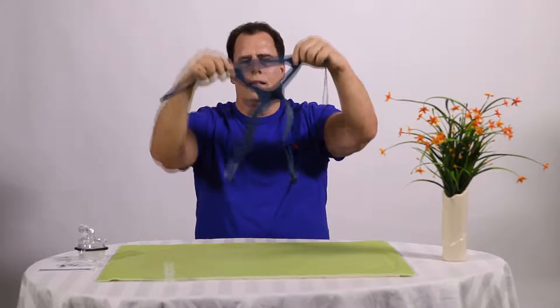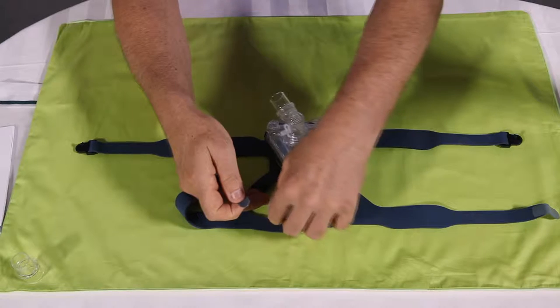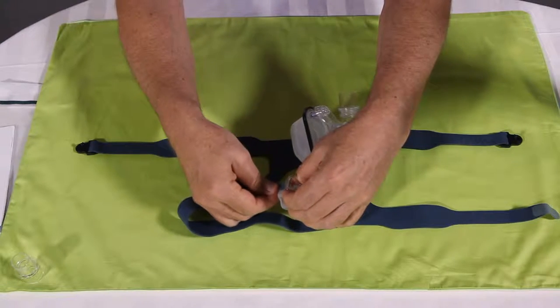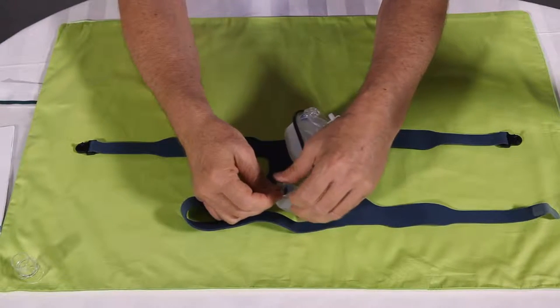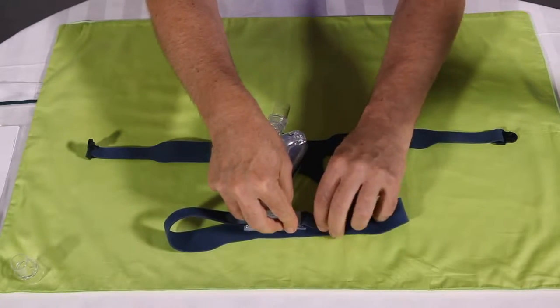Spread the headgear on the desk. Put the mask in the middle with heads up. Thread the upper straps of the headgear through the slots on the forehead support, and the lower straps on the mainframe clip slot.